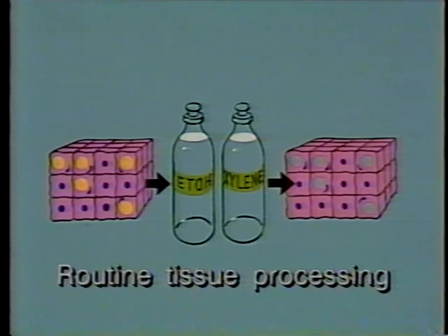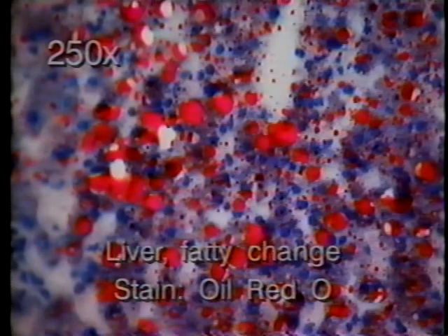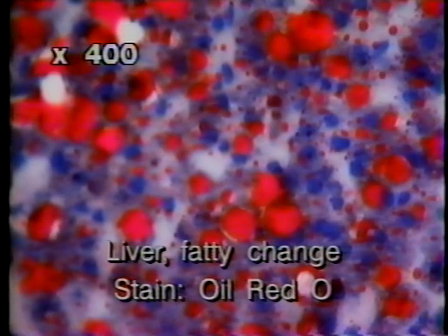The H&E sections of fatty livers you have seen were processed in the routine manner, which involves exposure to various fat solvents. During such routine tissue processing, lipid was extracted from the tissue, producing the space or vacuoles where the lipid was before it was dissolved. This slide shows a section of liver prepared by frozen section technique to avoid contact with fat solvents. A red dye called oil red O was used to stain fat selectively. Here you see the lipid stained bright red in the hepatocytes. Under high magnification, the red-stained lipid is even more striking.